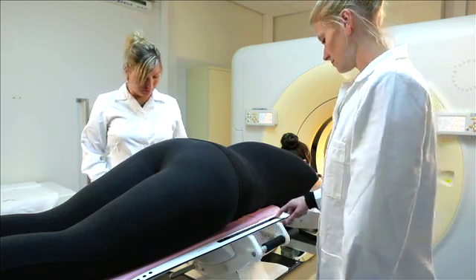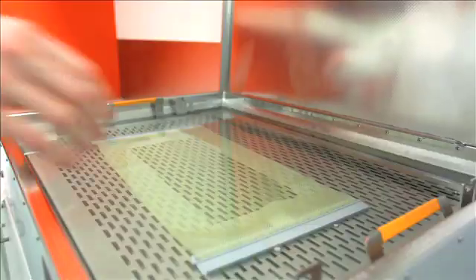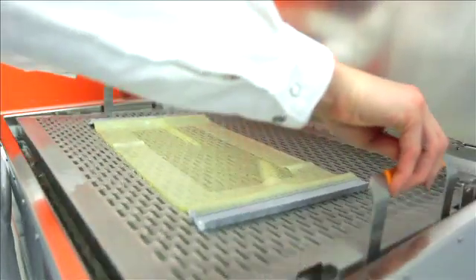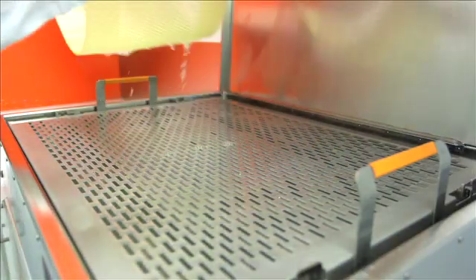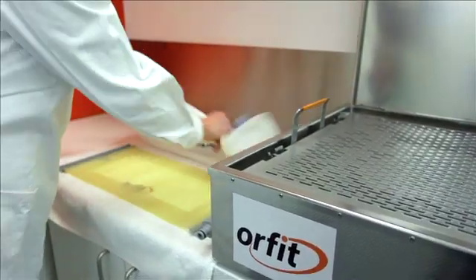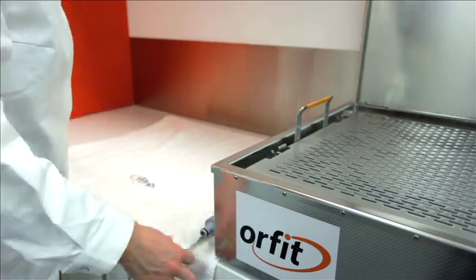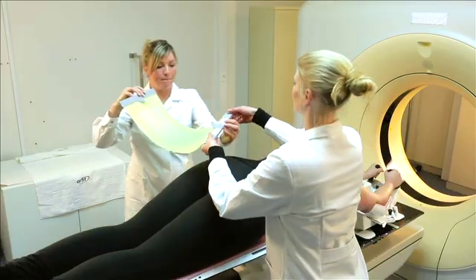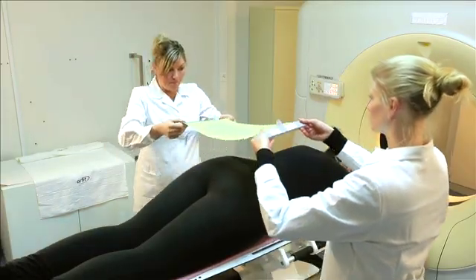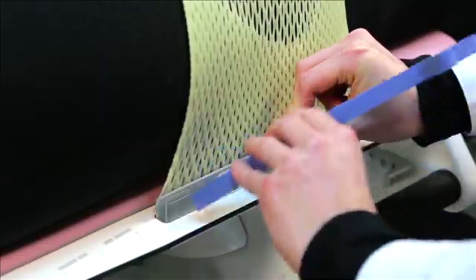Determine the correct position for the hip mask to cover the patient's pelvis — this will block the patient when you rotate the system. After the mask has been in the water bath for at least 4 minutes, take it out and remove the excess water using a towel. Place the mask over the hips of the patient, attach the profiles in the slots, and secure them with the blue EVA handles.